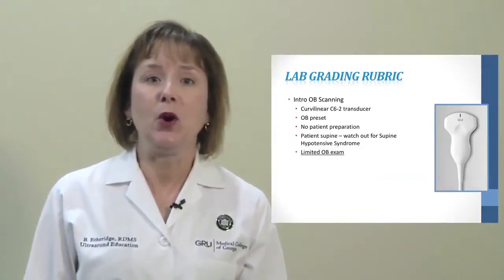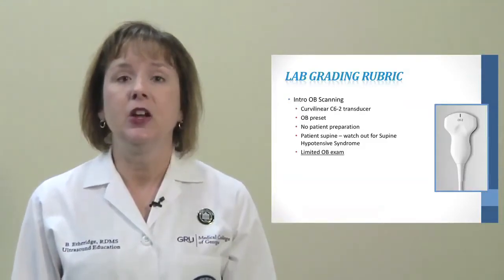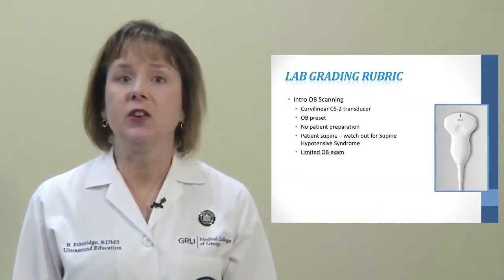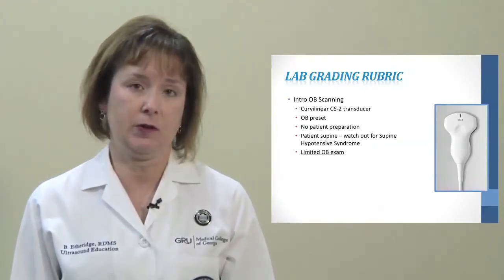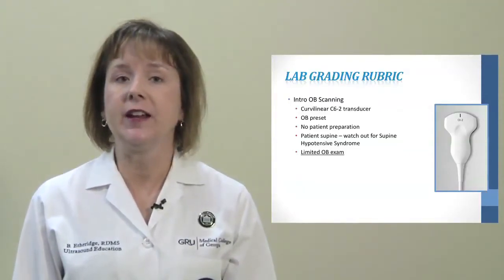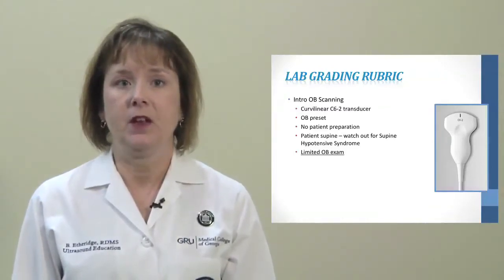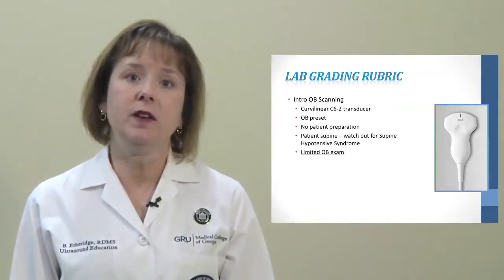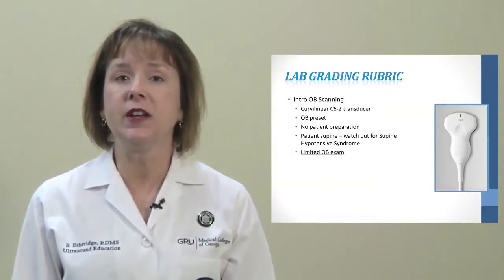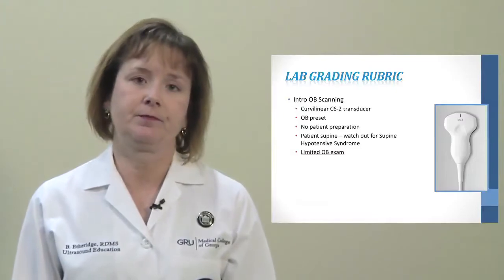Some pregnant patients have difficulty lying on their back supine due to pressure of the fetus on their great vessels, which is termed supine hypotensive syndrome. This position can cause them to feel faint or nauseous and can be relieved by turning the patient on their left side. On subsequent slides, I will be discussing some very basic ultrasound scanning for a limited OB ultrasound exam.